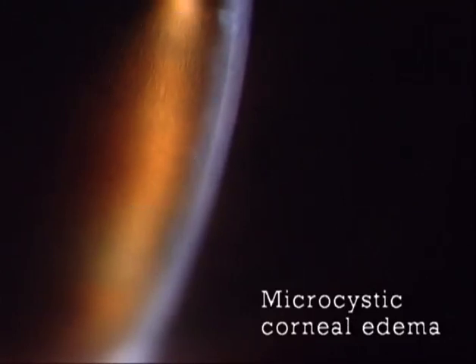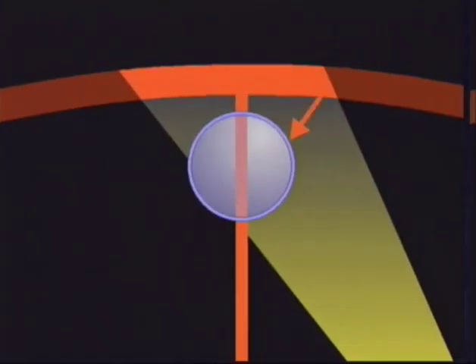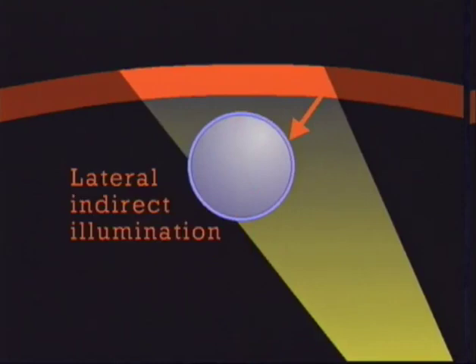When examining with high magnification, the field of observation is small. In order to bring the margins of the background light into this small field, the illumination angle should be decreased. For targets which are close to a reflecting screen, another technique can be taken advantage of: lateral indirect illumination. Light arrives at the target not only from the back, but also obliquely.